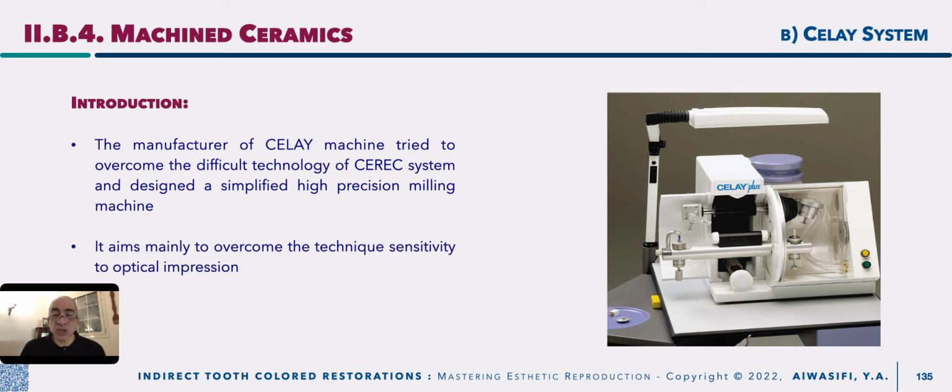Actually, it is not a digital one, it is just using a tracer to copy and duplicate the picture of your fitting surface and outer anatomy by the help of pro inlay, or what is similar to a wax pattern. It is similar to recreating or duplicating any key when you lost it or when you would like to get an extra spare key for any door or any car.